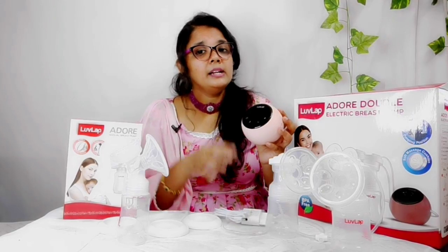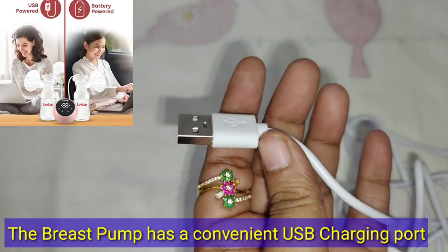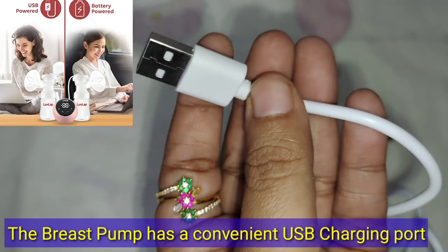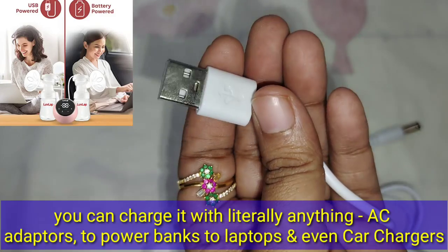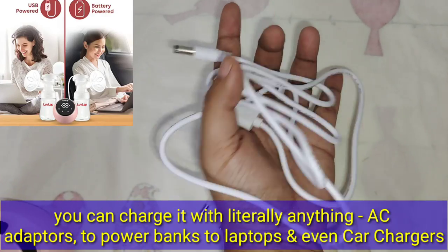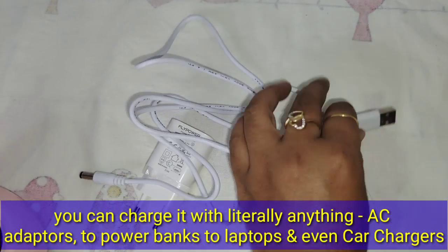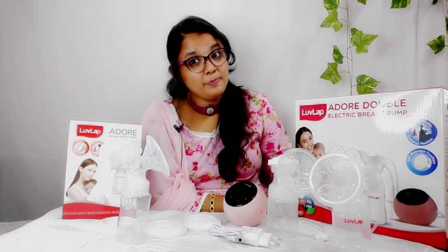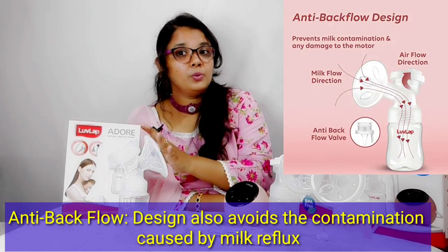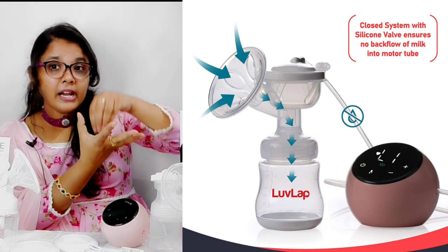The electric breast pump has a dual power source with a convenient USB charger. You can charge it using a laptop, a car charger, an AC adapter, or a power bank. There is also a special anti-backflow mechanism, so the milk from the bottle is directly collected without contamination.